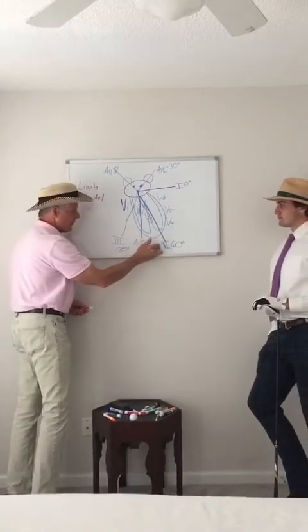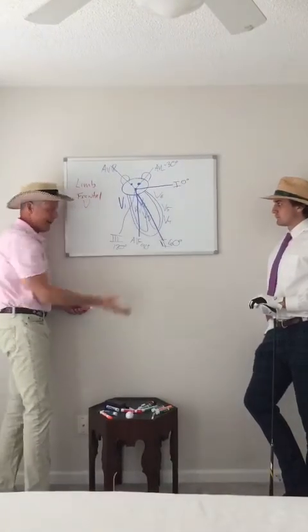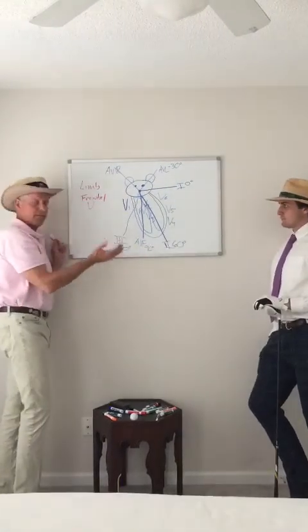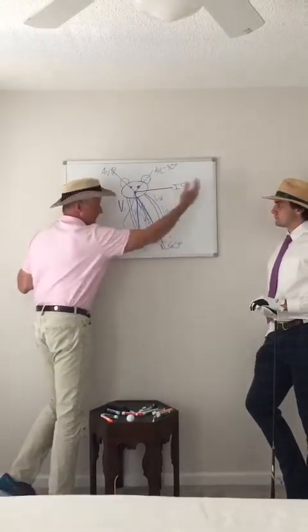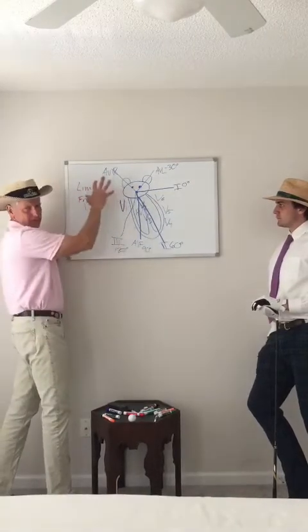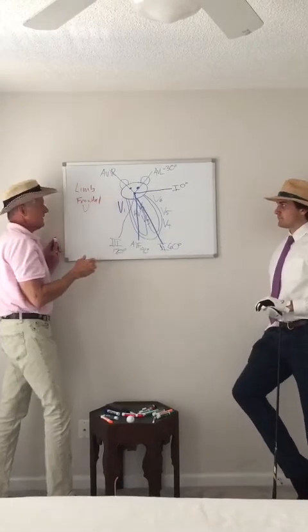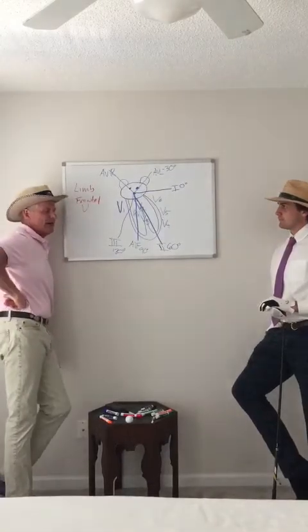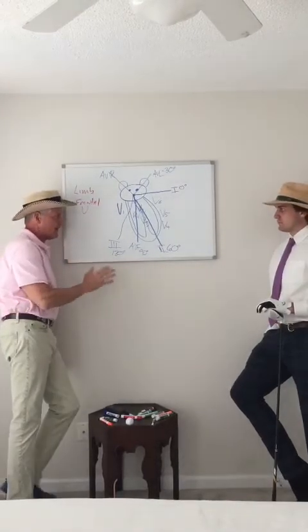So we see the inferior wall of the heart. As you can see, leads 2, 3, and AVF are near the rat's feet. So anything abnormal in the EKG in leads 2, 3, and AVF will reflect the problem at the bottom of the heart. Leads 1 and AVL are looking at the high lateral wall of the left ventricle. AVR doesn't really look at anything of any utility, so you might as well forget it, because everything's reversed. V1 looks at the right ventricle, V2 somewhat, and somewhat the posterior wall. When you think of right ventricle, think of posterior, the backside of the heart.